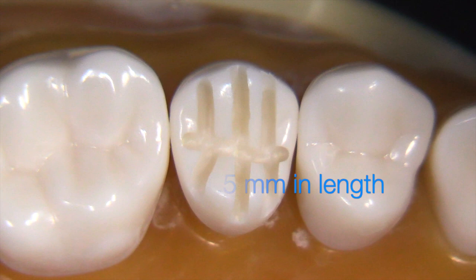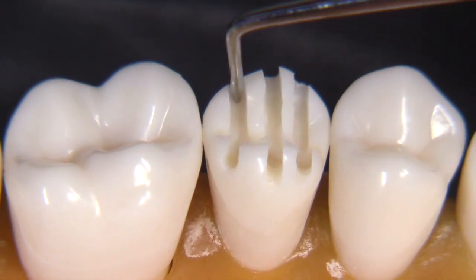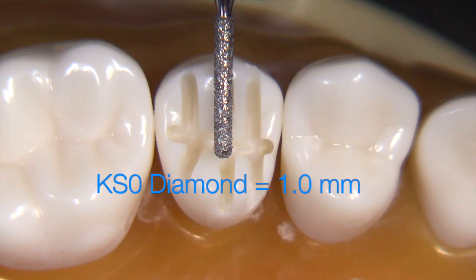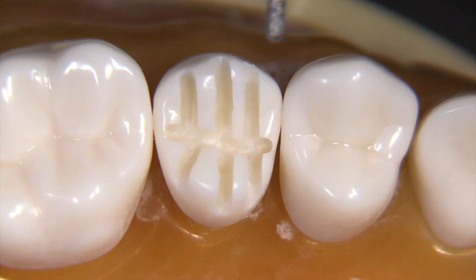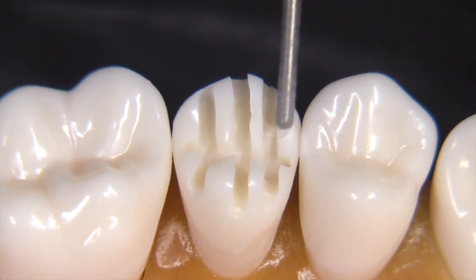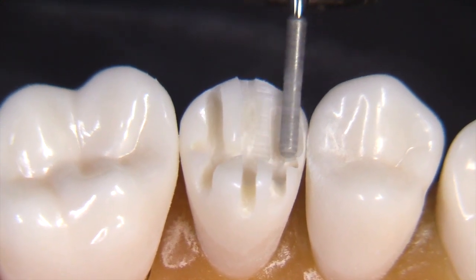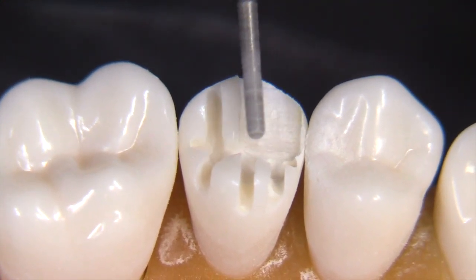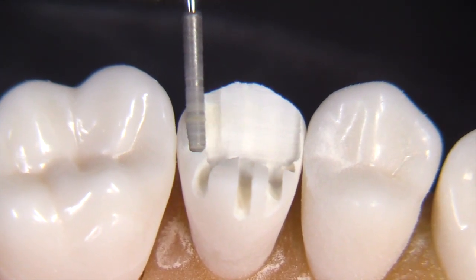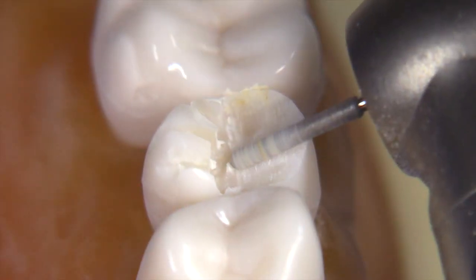We can use a 1.5 millimeter length RGS instrument — the tip of that is 1.5 exactly — and we can see that we've got the 1.5 millimeters of occlusal clearance needed for this situation. I'm going to use a KS0 diamond, which measures one millimeter in diameter. We're keeping it simple — just four burrs for the entire preparation. The KS0 is one millimeter in diameter, cylindrical in shape, not tapered, with a rounded and slightly flat end. It's a fairly coarse diamond with 100 micron diamond particles, so it works very efficiently.